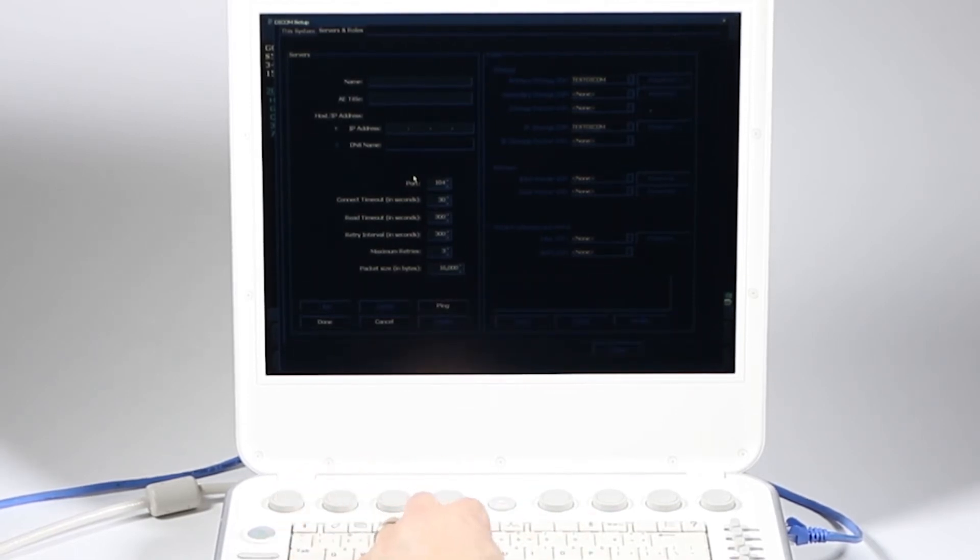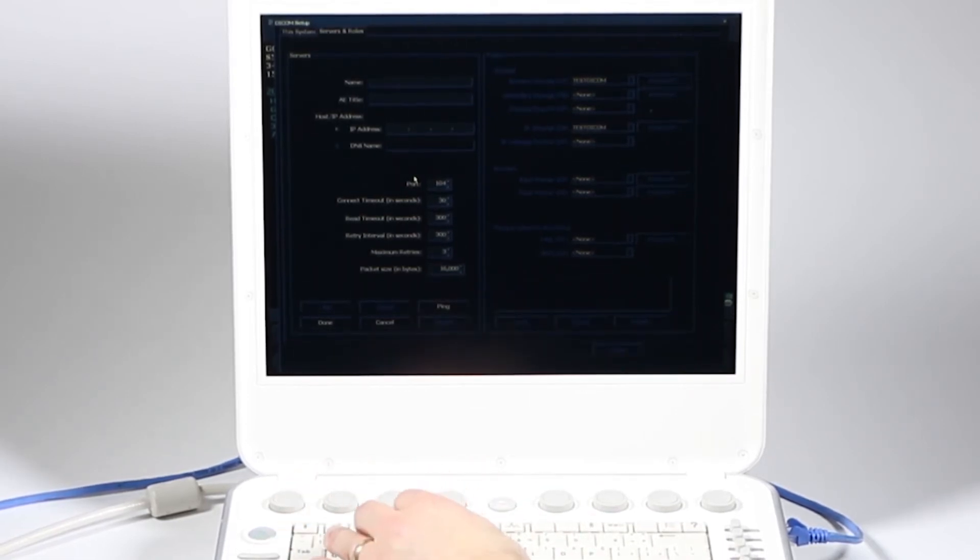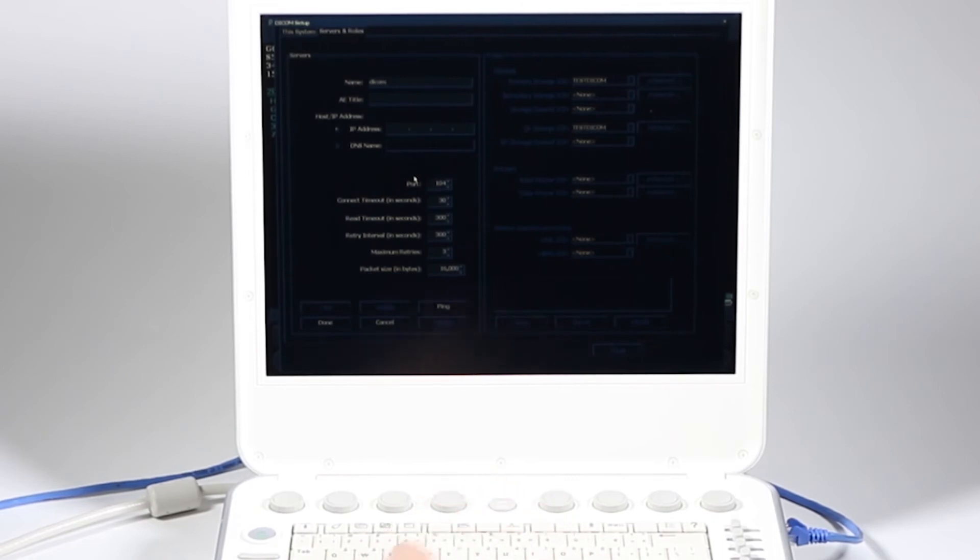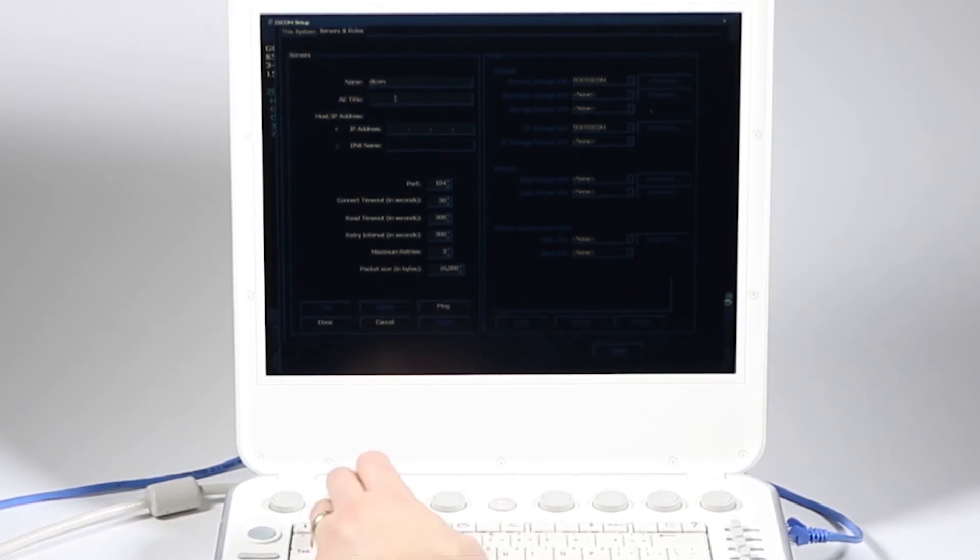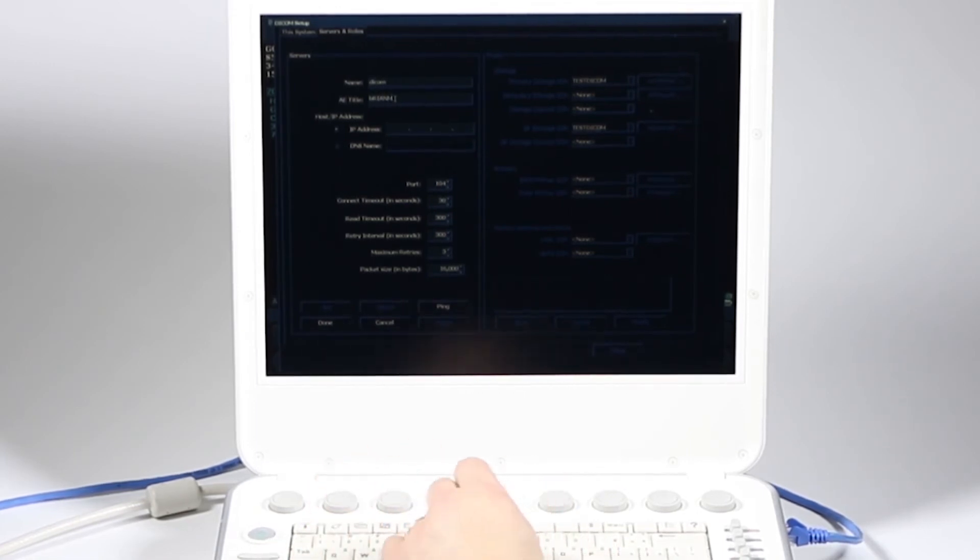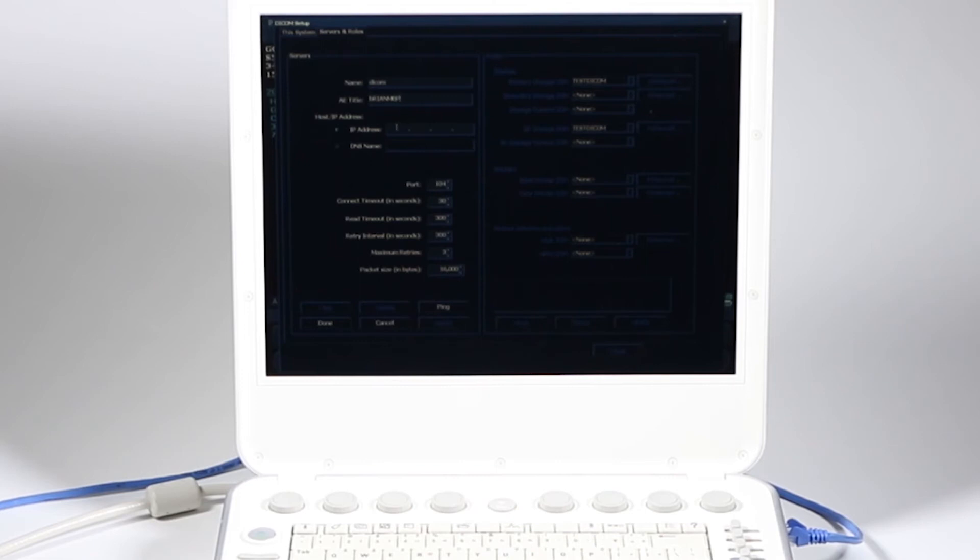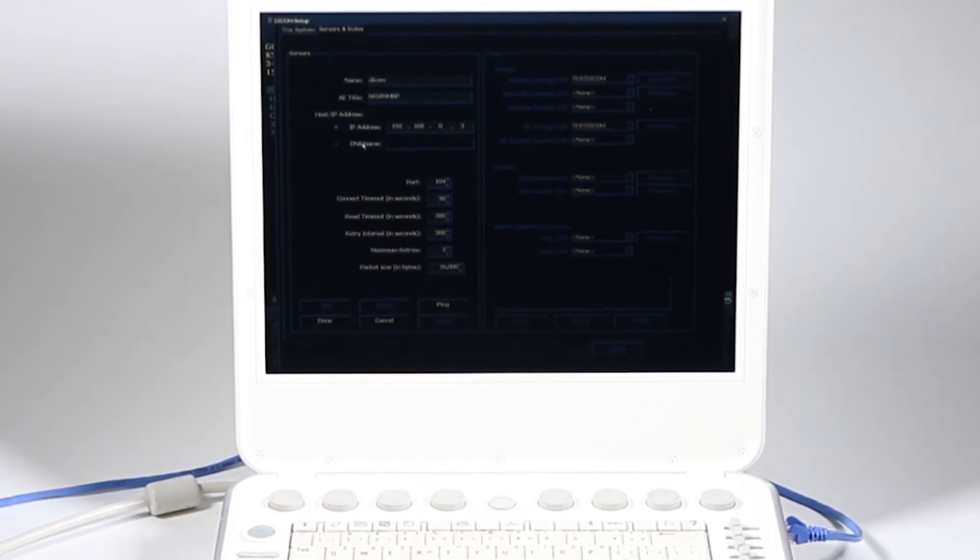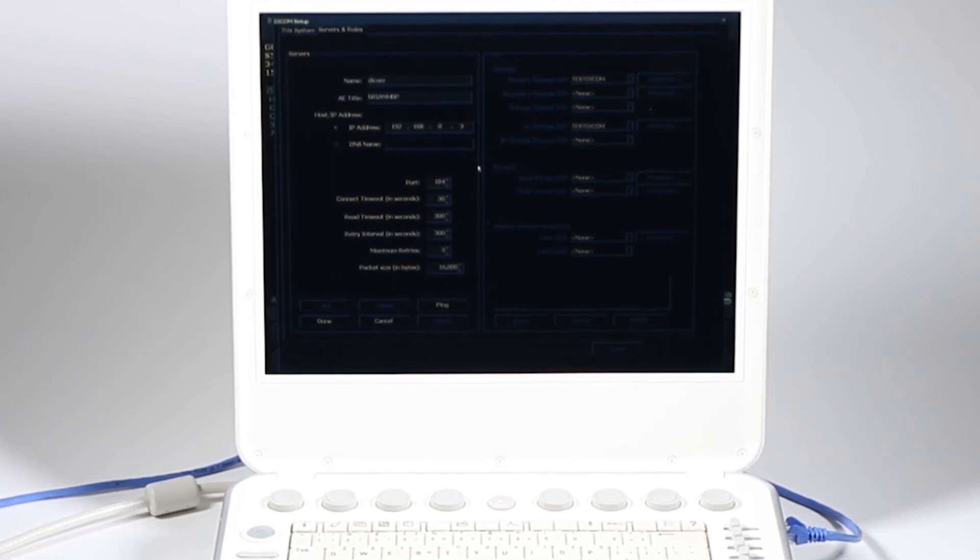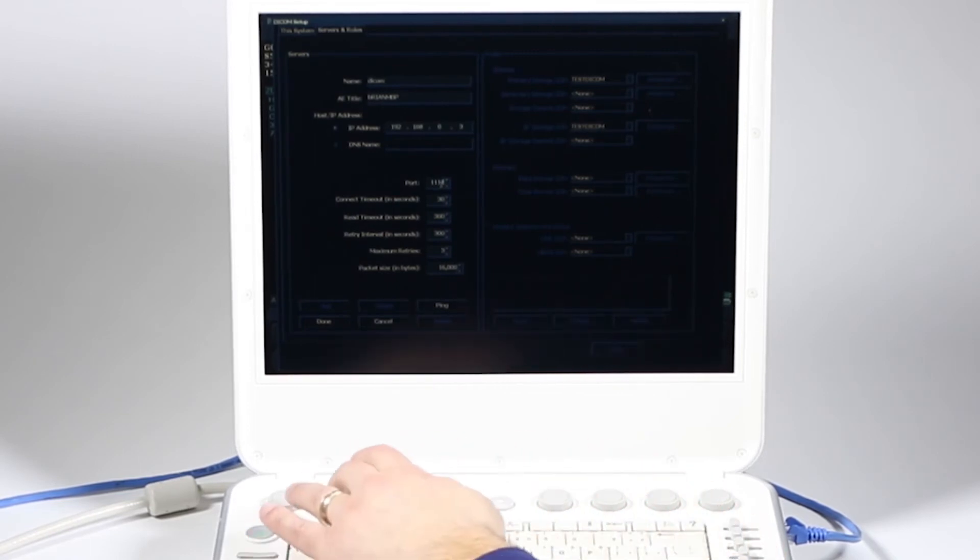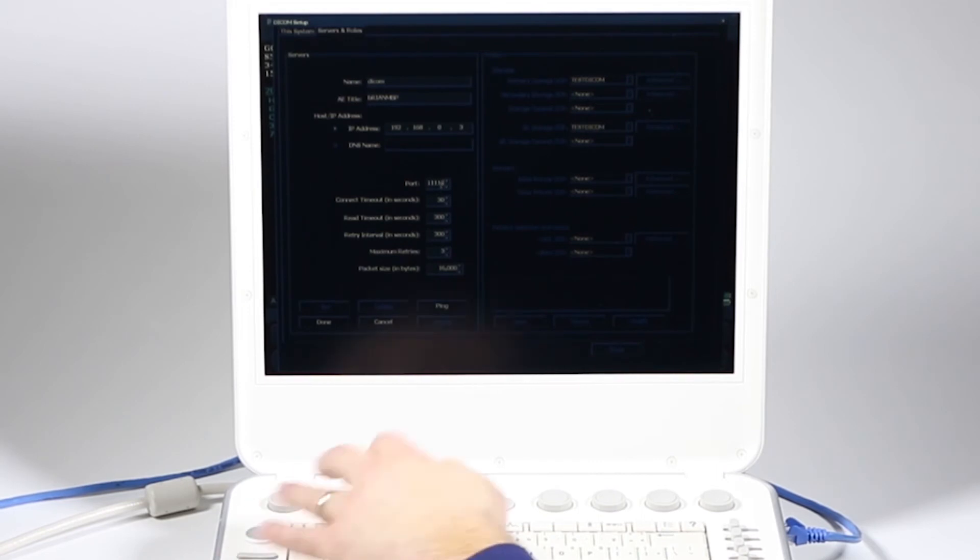Here's where I'm going to enter all that information that the PACS provider gave me. I'm going to call this network that I want to use. I'll just say DICOM. Then I add my AE title that was given to me by the DICOM server, and mine is BrianMBP. The IP address that the person from the server gave me. I'm not worried about the DNS name here. They gave me a port number.